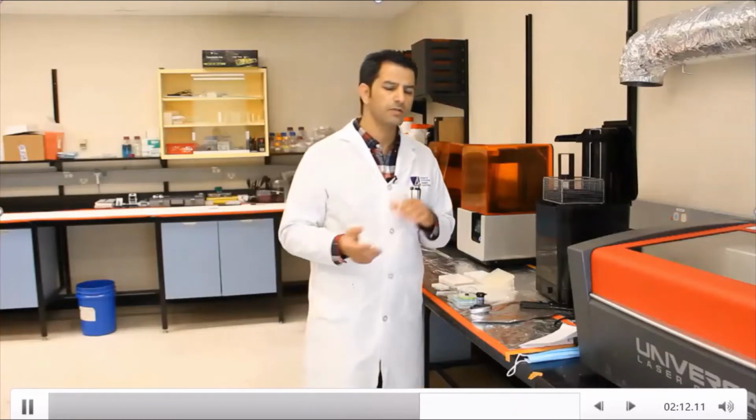But mainly the commercial glucometers in the market are categorized in group 1 and group 2. Also, there are some non-invasive electrodes that work with sweat, tears, and saliva in the market. The four or five main components of the electrochemical sensing are analyte, biorecognition section, transducer electrode, and display. And the electrode itself is divided into three components: counter electrode, reference electrode, and working electrode.